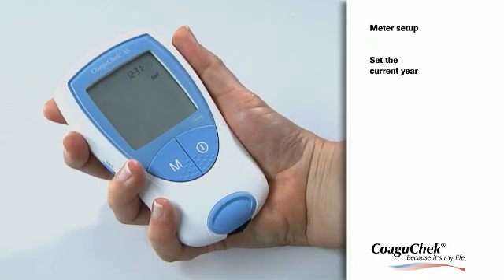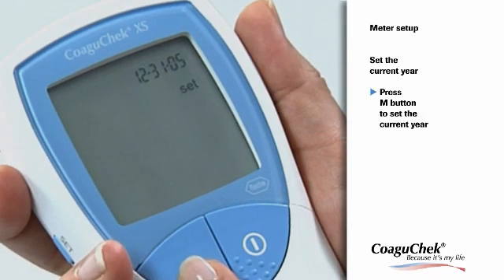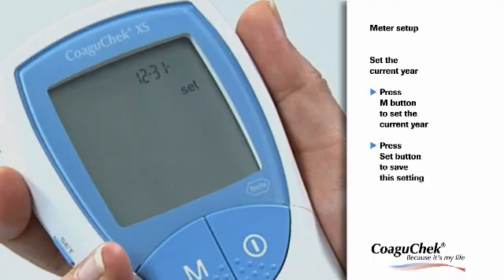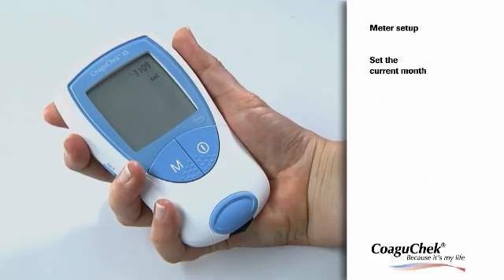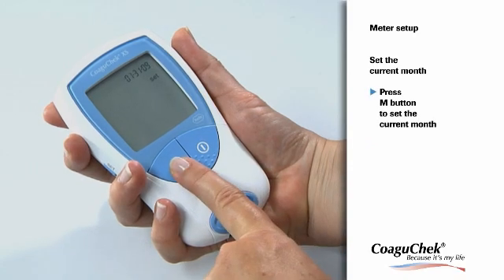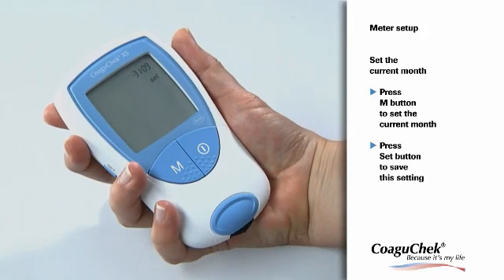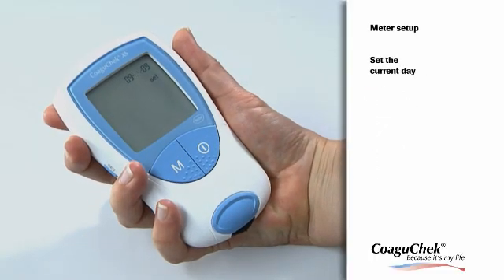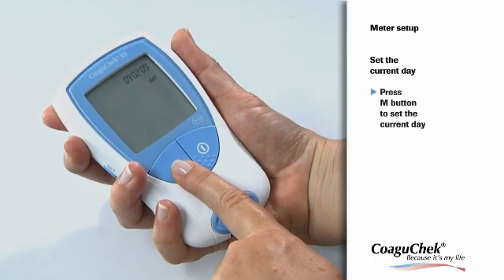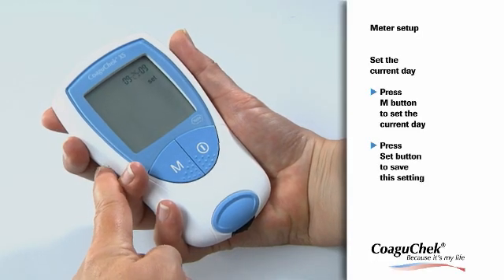The next step is to set the current year. Press the M button to change the flashing number until the correct year is displayed, and save your setting by pressing the Set button. Now the preset month is flashing — press the M button until the correct month is displayed, then press the Set button to save. The final step is to set the current day. Press the M button to change the flashing number until the correct day is displayed, and once again save by pressing the Set button.